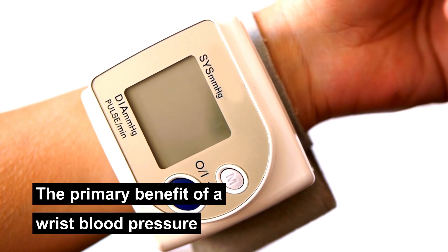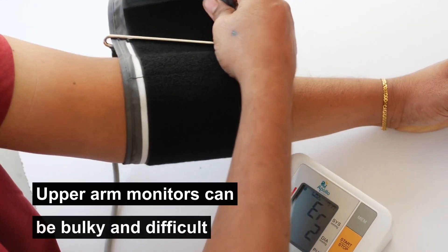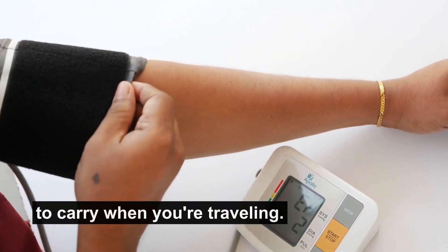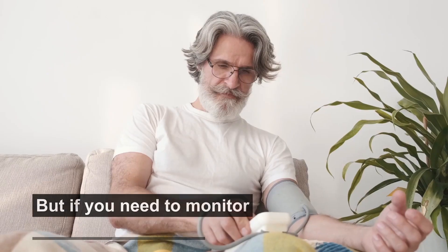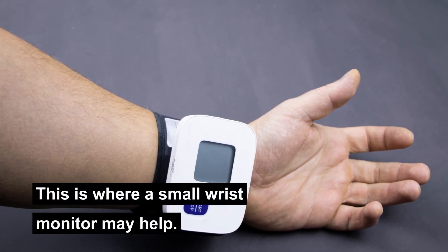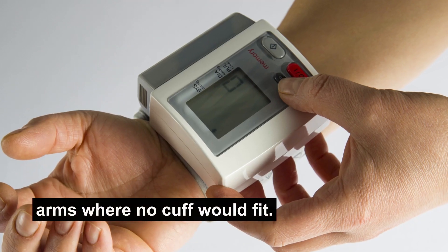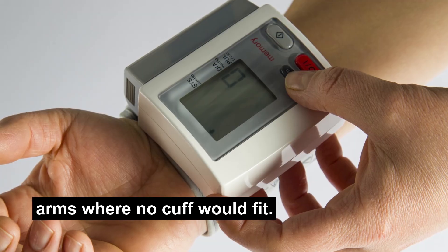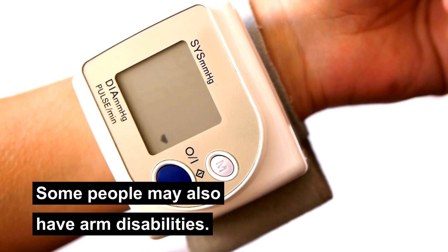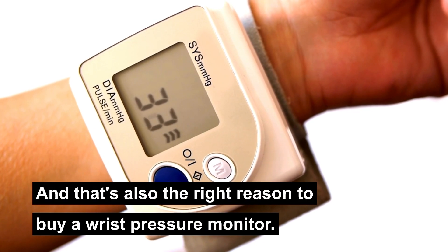The primary benefit of a wrist blood pressure monitor is its portability. Upper arm monitors can be bulky and difficult to carry when you're traveling, but if you need to monitor your blood pressure daily, you must carry it along — this is where a small wrist monitor may help. It can also be useful for those who have large upper arms where no cuff would fit, or for those who have arm disabilities.